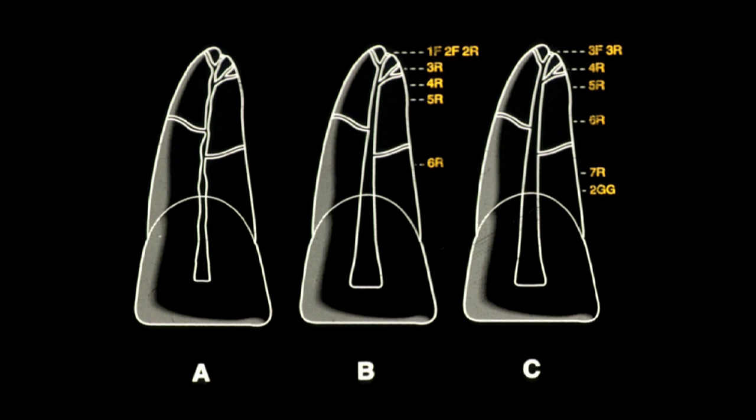Having done that, we tried to do this in clinical situations. We didn't have NiTi in those days. All we had was files, reamers, and Gates Glidden drills. So in illustration A, you have an unshaped root canal system, and in B, you would take files and follow to the terminus, and at some point you began what was called serial reaming and shaping. We didn't have NiTi again. So we would take pre-curved reamers and we would slide them short of maximum resistance and carve on the outstroke.